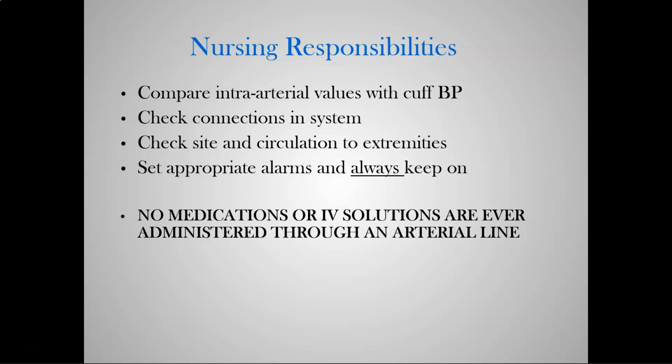I have walked in after a blood gas had been gathered. The individual that was there prior, gathering the blood gas, had left the stopcock in that position. My monitor was even alarming, hey, zeros. Actually, it was negative 300, which is not an actual pressure, not a thing. Walked in the room, had a pretty good pool of blood on the left side of my patient, and I couldn't even see it because they had put the blanket back over the arm. In this case, my transducer, where my stopcock was, was taped to my patient's left arm, up by the gown. So, you may have to troubleshoot.